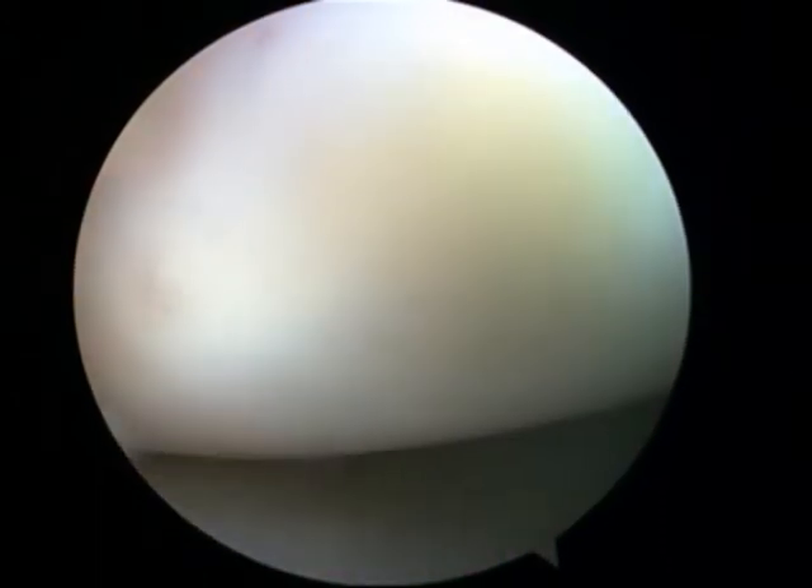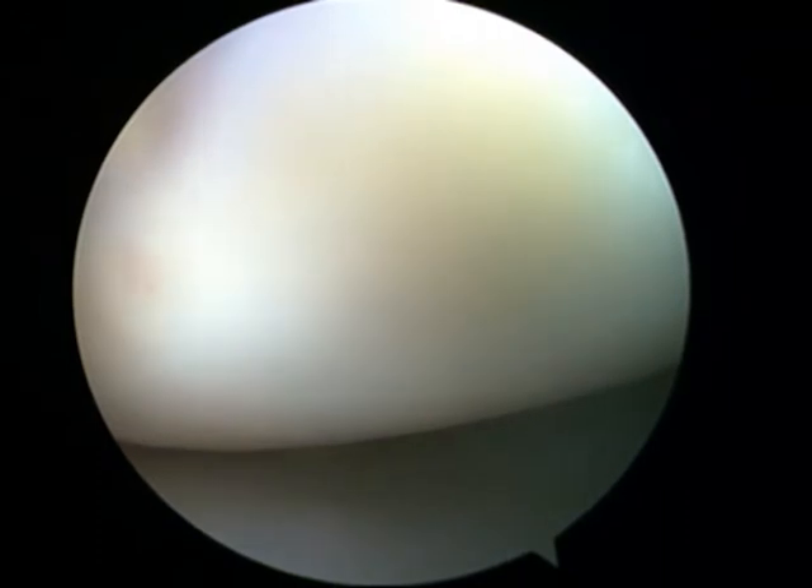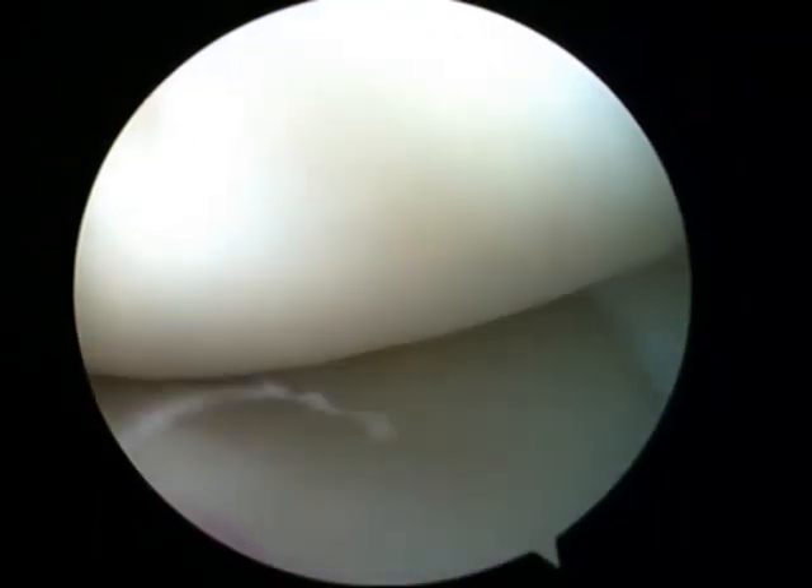On one side they put one hole with a camera and a light, and a hole in the other side of your knee for the tools. And he's just checking the cartilage under there.